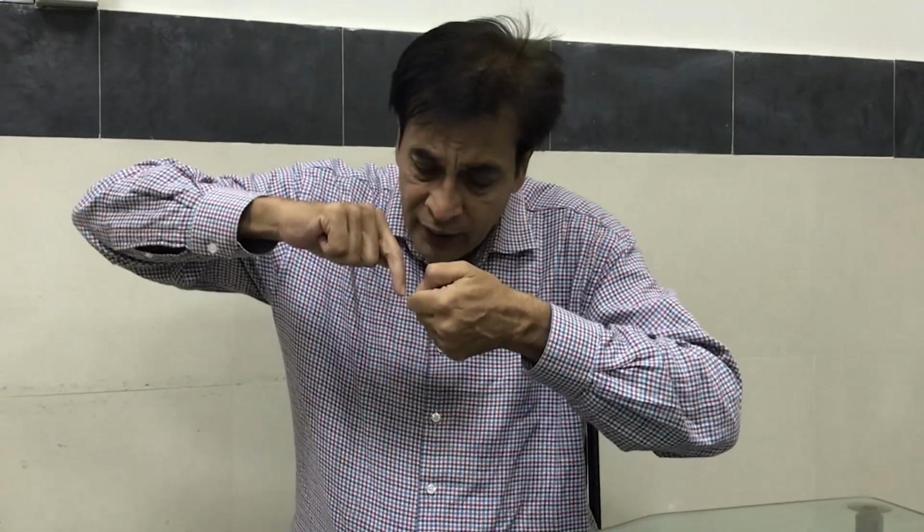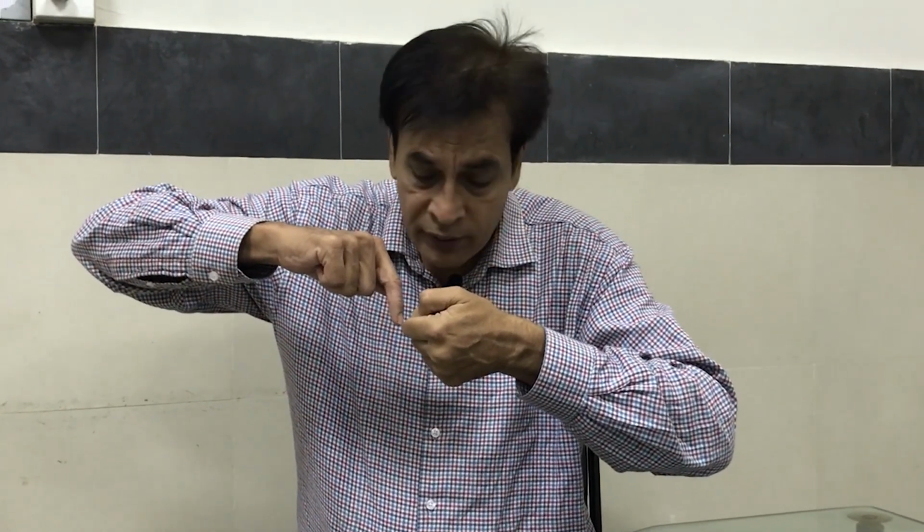After making an incision in the mucosa, you will take tonsil dissecting forceps in your right hand, and then you will retract the mucosa. Then you will take straight artery forceps in your right hand.